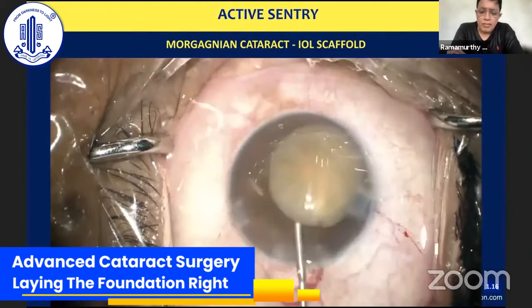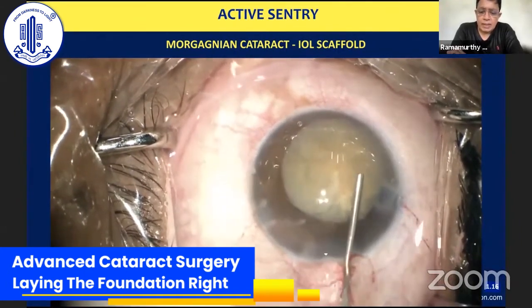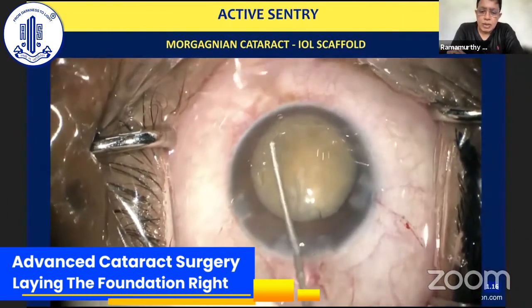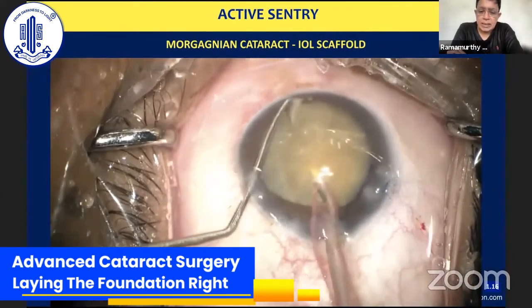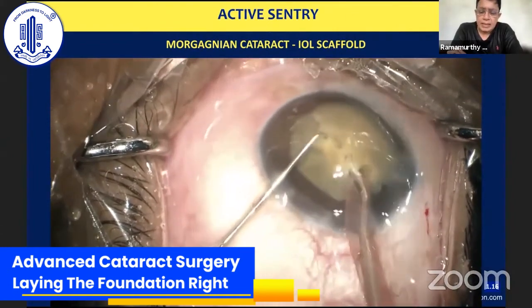Here, actually, even before I deal with the nucleus, I implant a multifocal intraocular lens into the capsular bag. And here, there's a dispersive viscoelastic that's being injected into the eye so as to coat the endothelium quite adequately. As we discussed earlier, here almost entire phacoemulsification is going to happen in the anterior chamber.